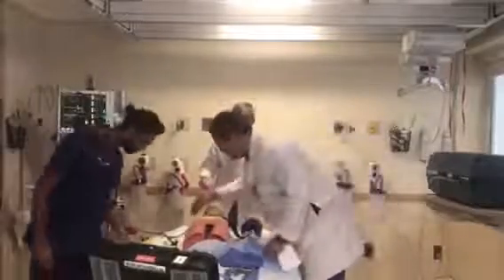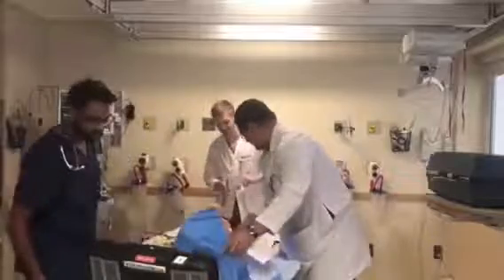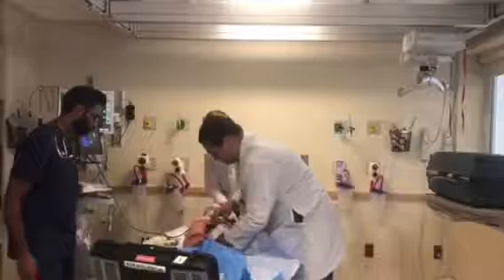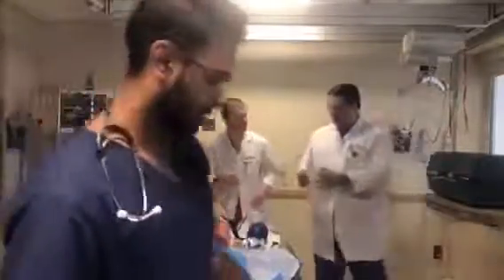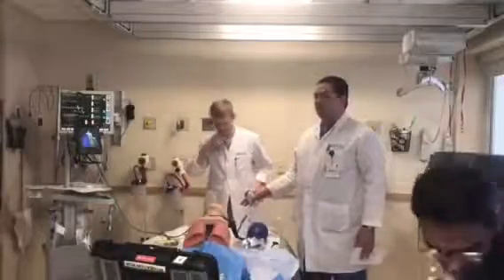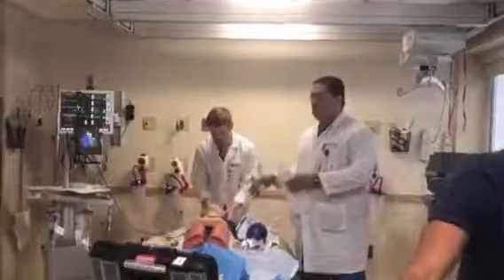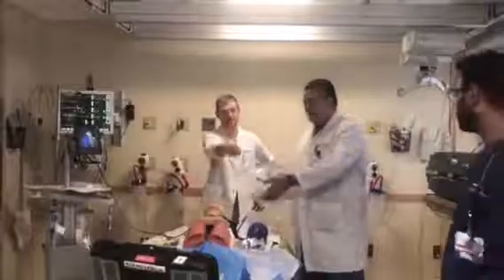This is a regular LMA. You need the intubating LMA. So I gave you the wrong one, Professor Ravi, for educational purposes. But I did see the intubating LMA. All right. So basically, I removed this from the airway algorithm. It should not be done. It only should be done if you don't have the intubating LMA. If you have the intubating LMA, there's no need.